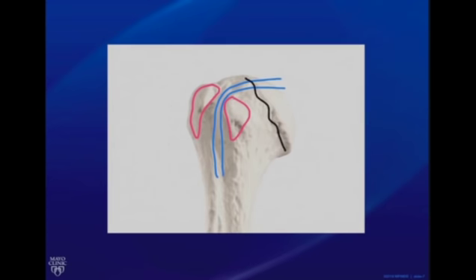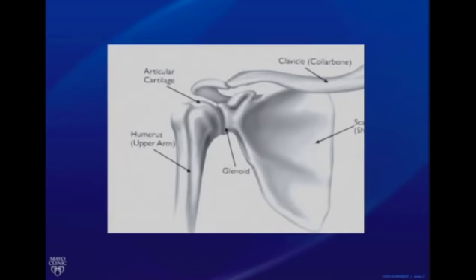This wavy line is the humeral head, anatomical neck, and the second line is demonstrating surgical neck. So as we go further, this is just an illustration to show how the subscapularis muscle tendons cross the bicipital groove and keep the tendon inside.